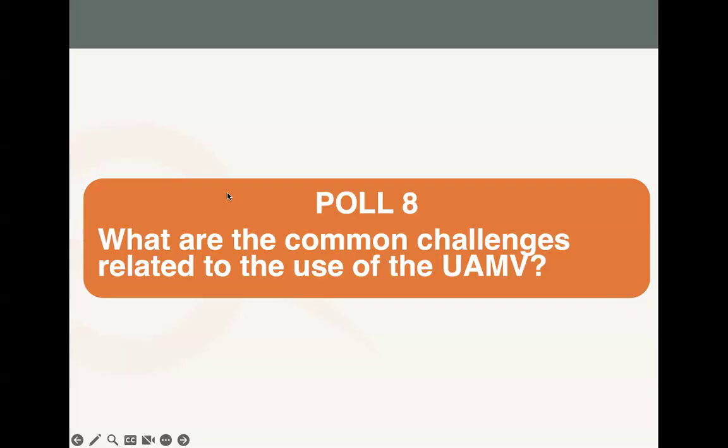So if, for instance, your tube is kinked, or maybe there are secretions within the endotracheal tube, and the pressure rises, that rise in pressure will be detected by the vent as a result of the flow sensor. And then that will give you an alarm, which should prompt you to react in order to make sure that the patient is safe.